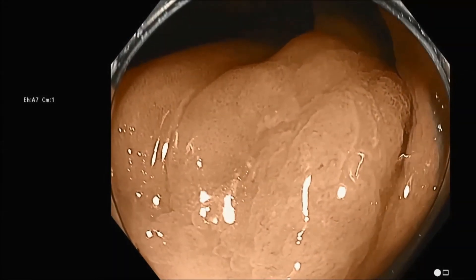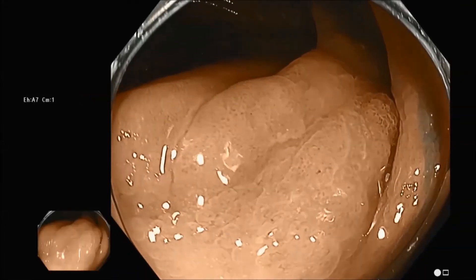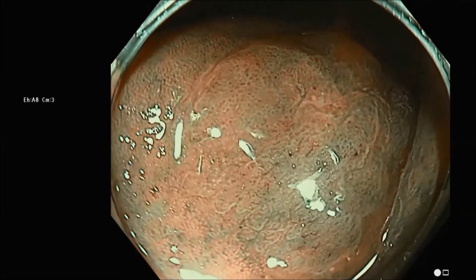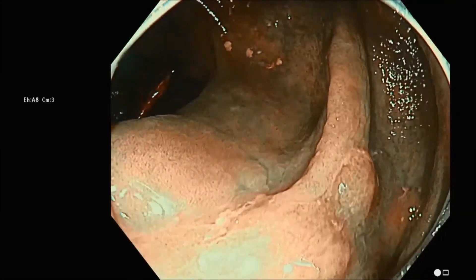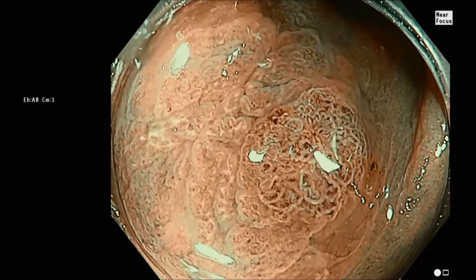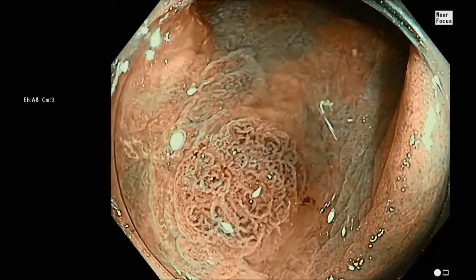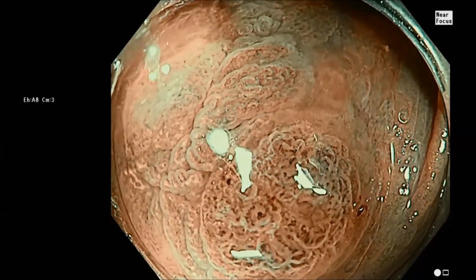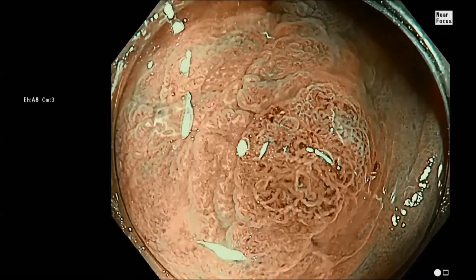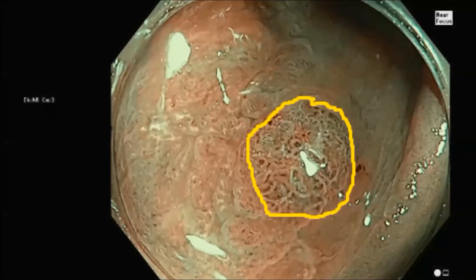The second step in the sessile serrated polyp to cancer sequence is the sessile serrated polyp with cytological dysplasia, which combines the features of the SSP with a conventional adenoma. Most of this lesion is SSP, but over on the right edge we see a small five millimeter area with typical features of a conventional adenoma — very dense in blood vessels and tubular pits. This is the dysplastic portion of the SSP with cytological dysplasia, delineated within a yellow circle in the still photograph.